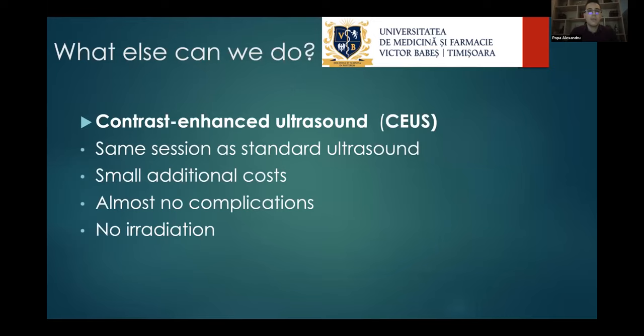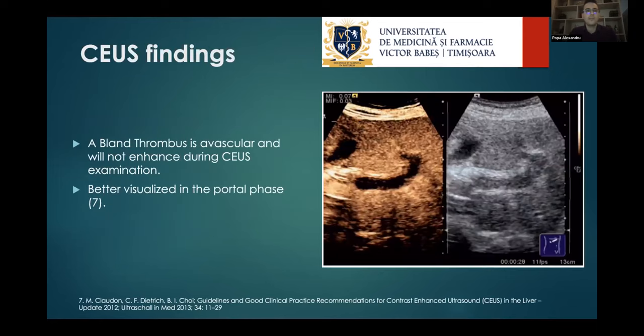We can perform contrast-enhanced ultrasound, and we should perform it immediately after grayscale ultrasound in the same session, because it has a small additional cost, without any irradiation and with almost no risk of complications. So how does it look on CEUS?